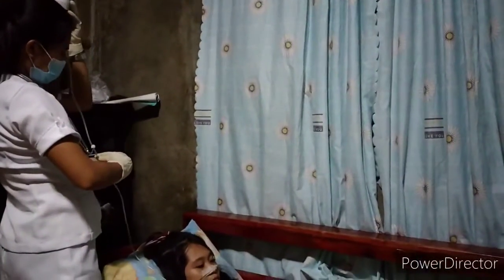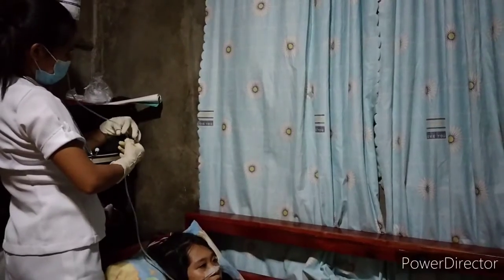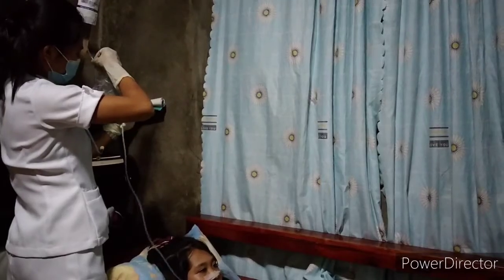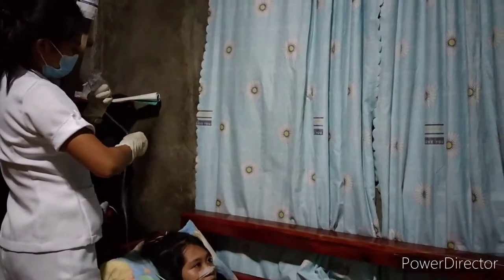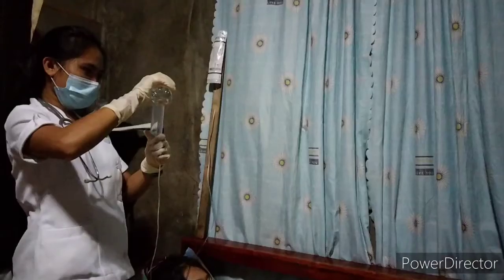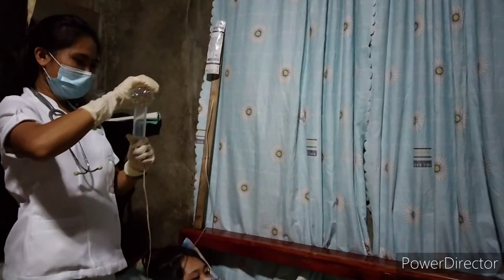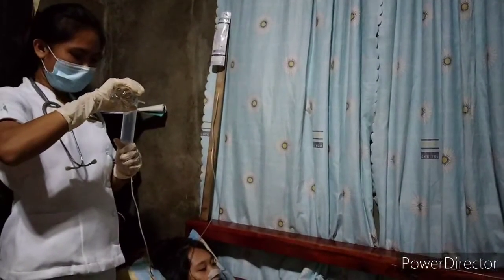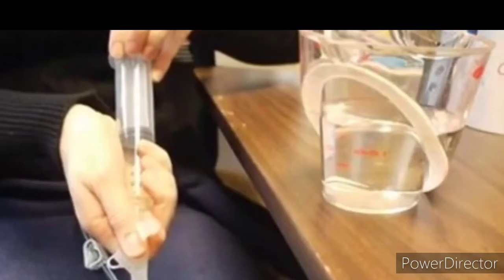Advance tube feeding gradually. Tube feedings should be advanced gradually to prevent diarrhea and gastric intolerance to formula. When tube feedings are not being administered, cap or clamp the proximal end of the feeding tube. This prevents air from entering the stomach between feedings. Administer water via feeding tube as ordered with diluted formula. This provides the client with a source of water to help maintain fluid and electrolyte balance. Rinse bag and tubing with warm water whenever feedings are interrupted. Rinsing bag and tubing with warm water clears all tube feedings and reduces bacterial growth.